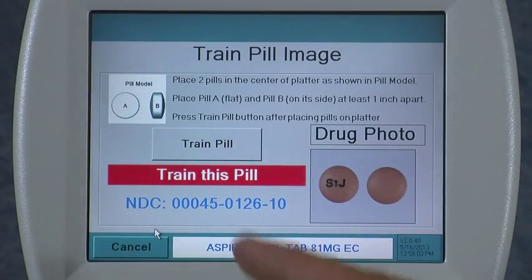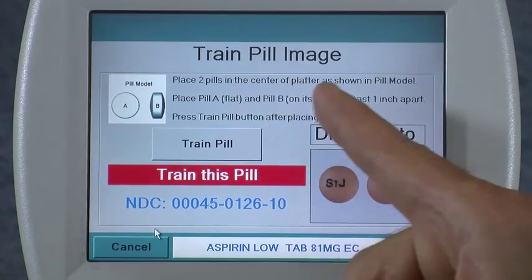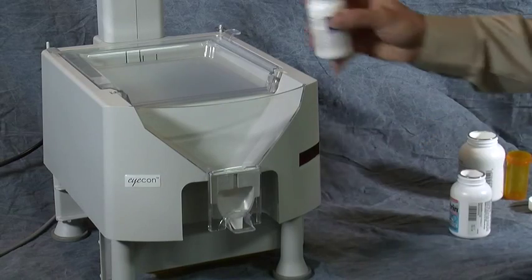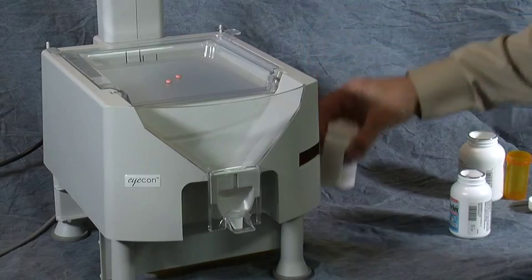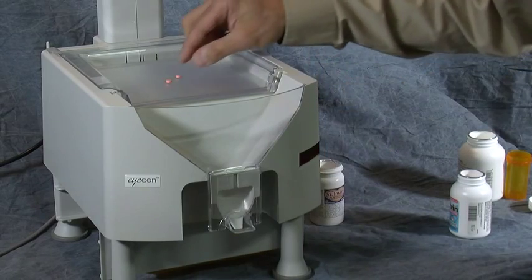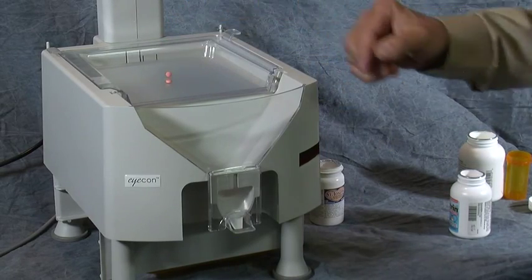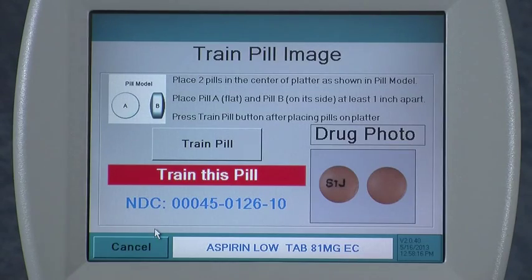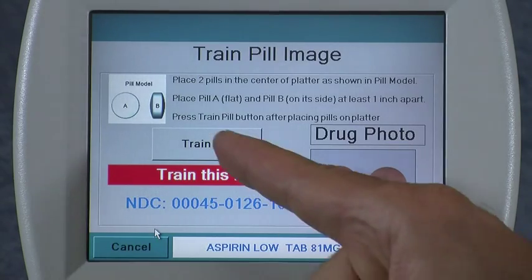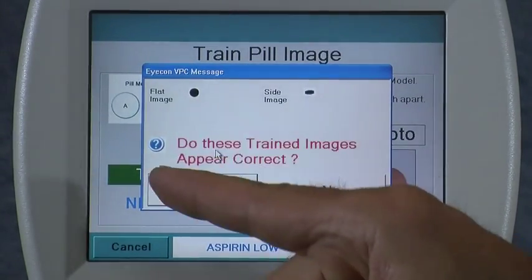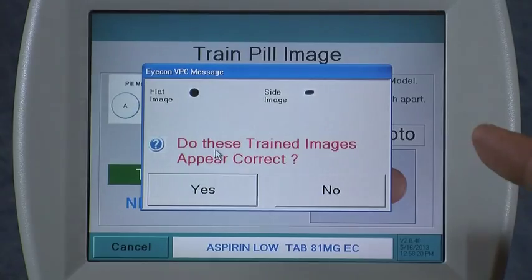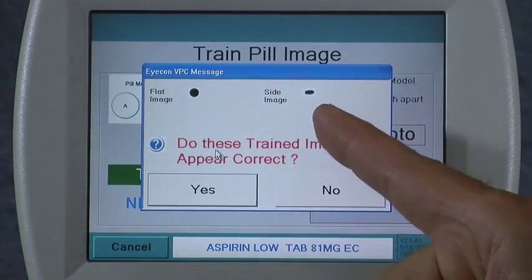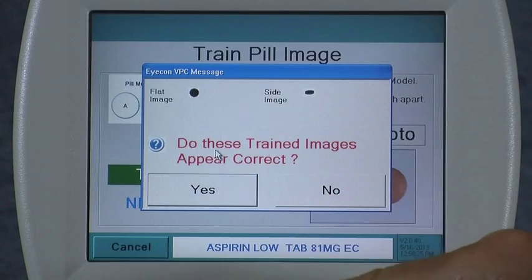The ICON then prompts you to place two pills in the tray near the center — one flat and one on its side. You simply dump a couple on the tray somewhere near the center, making sure they're not touching each other and they're not way off near the edge, then press train pill. The ICON shows you the two images, one flat and one on its side. If those look correct, you press yes.